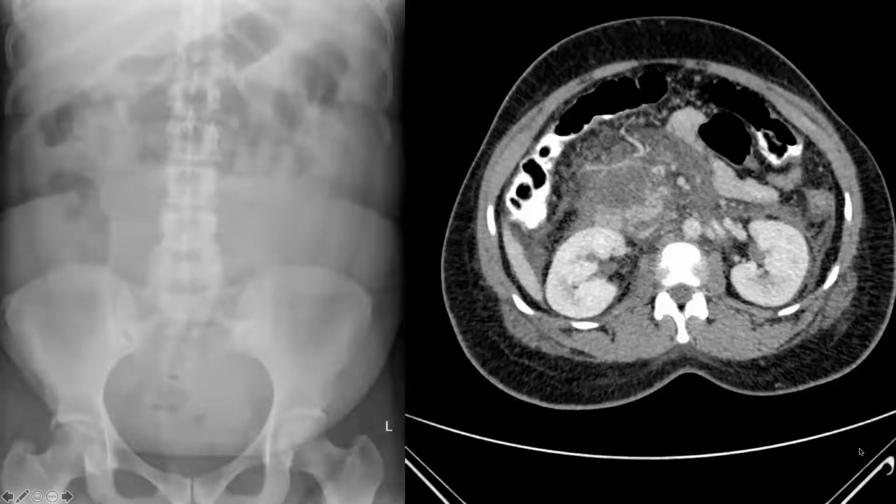And here is the CT of the patient. So you see what you see on the plain film, you have 2 dimensions and you have very, very limited soft tissue contrast. And now you have here cross-sectional imaging utilizing X-rays again, but because of how the machine is designed, you have different detectors. You can see much better soft tissue differentiation, which is also facilitated by the ingestion of oral contrast, as well as the administration of IV contrast.